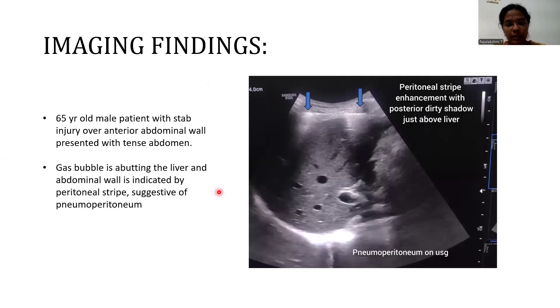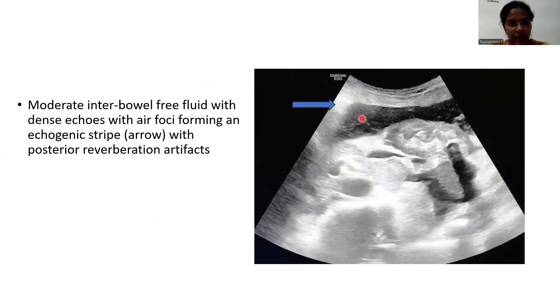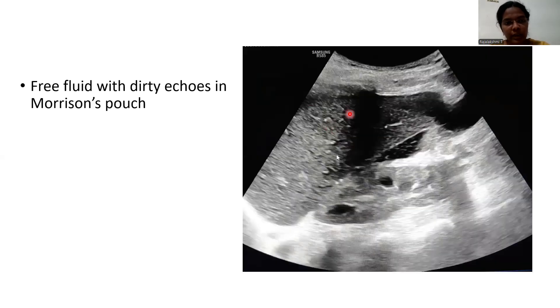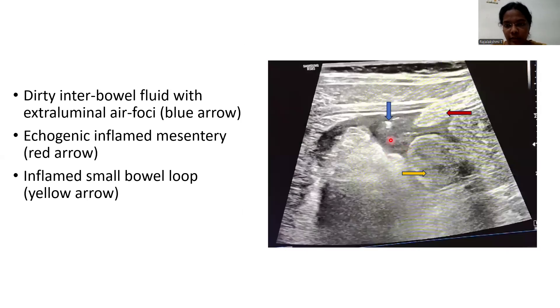Imaging findings: the most commonly found findings were the peritoneal stripe enhancement with posterior dirty acoustic shadowing just above the liver. Most patients also had moderate inter-bowel free fluid with dense echoes, air foci forming an echogenic stripe showing posterior reverberation artifact. You can see free fluid in Morrison's pouch with dirty echoes, echogenic mesentery, inflamed bowel loop, inter-bowel free fluid with dense echoes, and extraluminal air in this case.